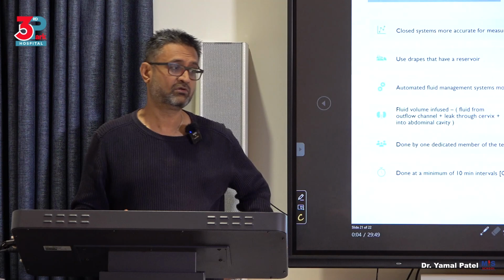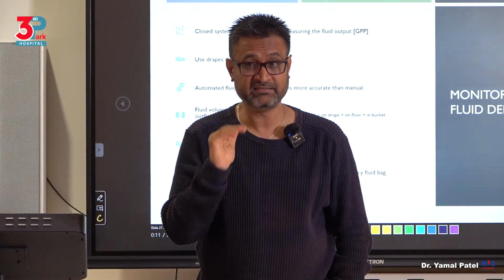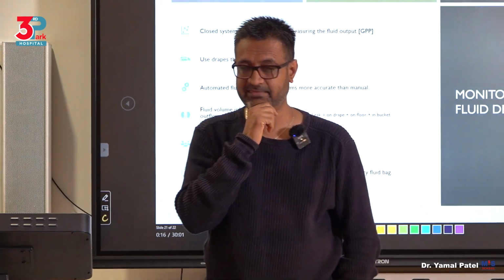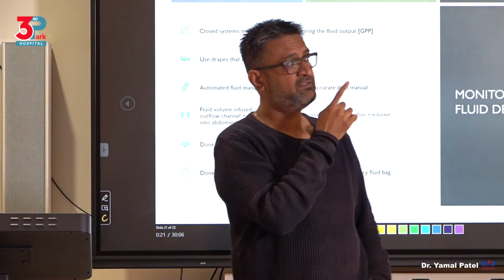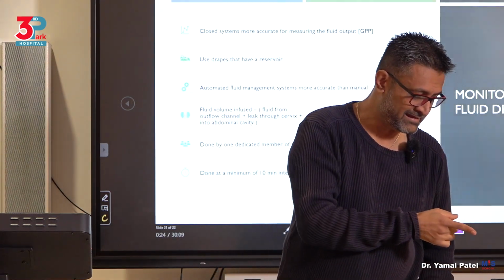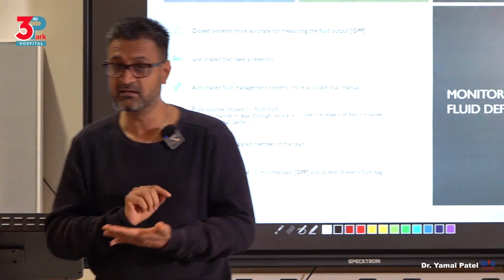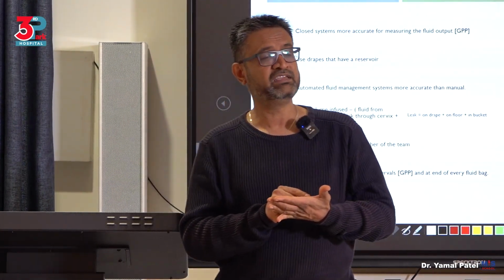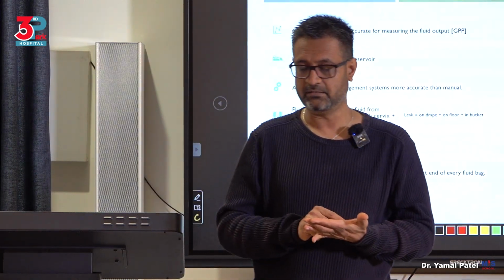Have a good system to manage the fluid in and out. So it means every 10 minutes, a nurse should, in the ideal situation, I'm telling you what is ideal, guys, there's one nurse whom you dedicate in that theater to fluid, okay? That nurse is monitoring in and out, calculating, and every 10 minutes or so updating the surgeon team: right now, 4 liters of saline used, negative deficit at the moment is 500 ml.